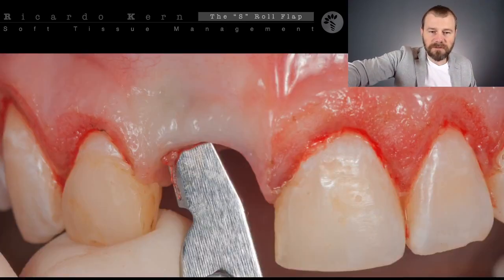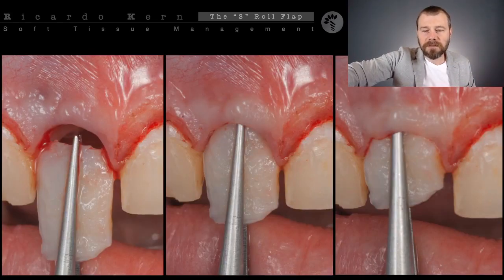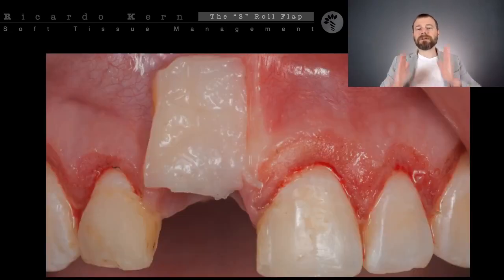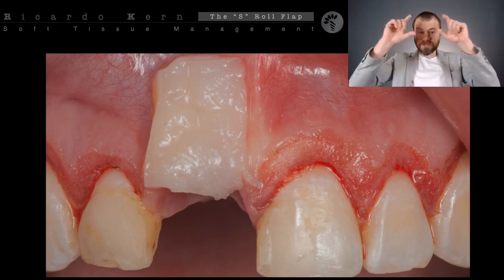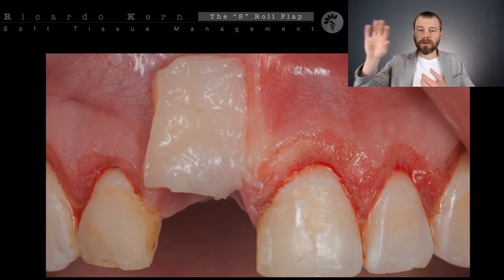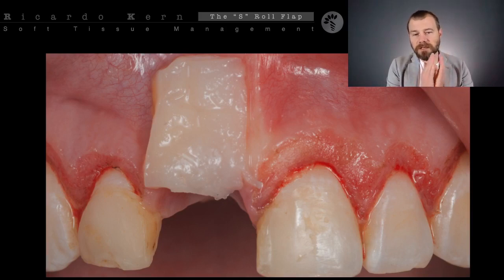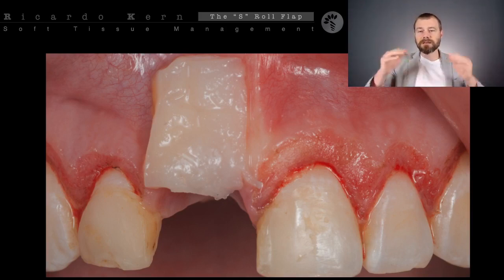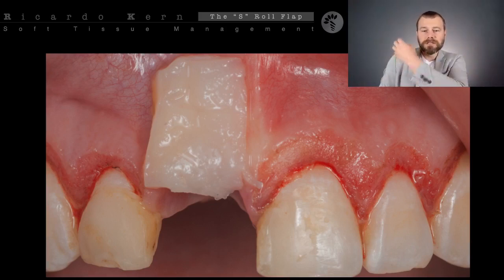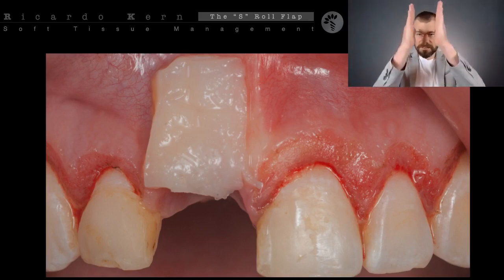These are the pictures of the blade. You're going to see more cases, okay? And my connective tissue has the proper space to be brought inside. Why is this vertical orientation of my connective tissue, not a horizontal orientation? The question is, do I need to graft on the central incisors and the lateral incisor or just on the implant side? Just on the implant side. If you remember the occlusal view of the defect, I do not have a defect under the papillas, under the shoulders of the papilla. The bone is still there, okay? I just need to fix the center.